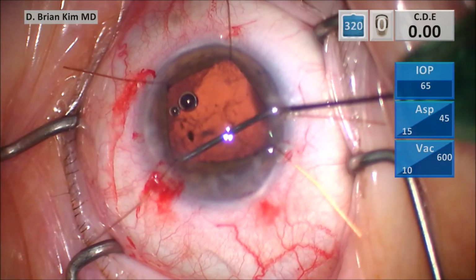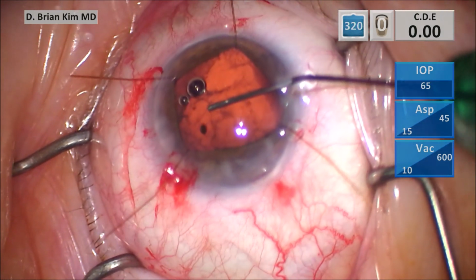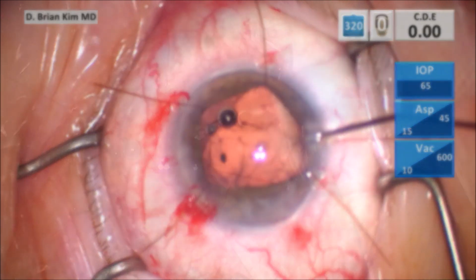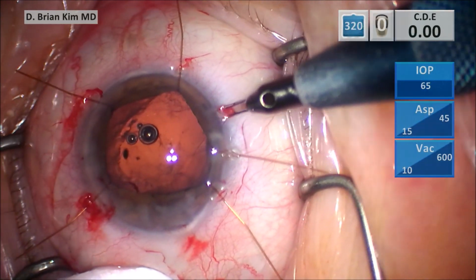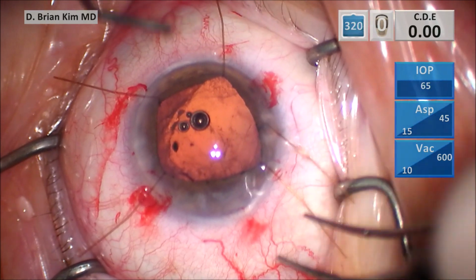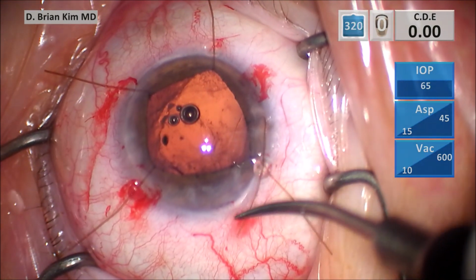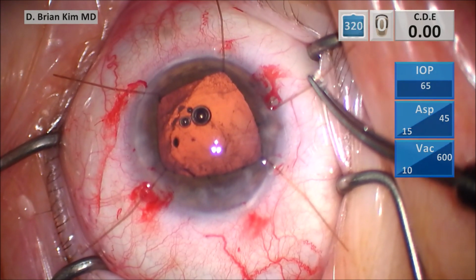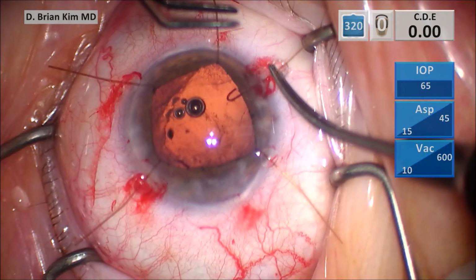But I don't have posterior capsule radialization. It's very important not to overfill the bag with viscoelastic when I do this. You can see here I'm creating another stab because I felt like that iris hook wasn't providing the correct retraction. I want it to be closer to where that anterior capsule tear is, so I repositioned that hook.